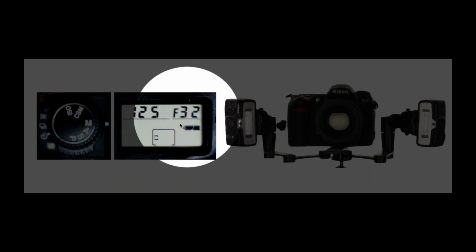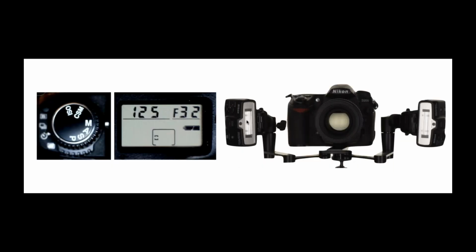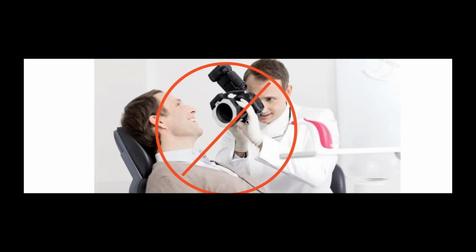Remember I showed you when I had an f20 compared to an f32, that the photograph appeared slightly darker on the f32. So how did I fix that? I just push the flash up a tiny bit and get a little more brightness out of the flash. But I'm getting a more accurate photograph, and I'm just brightening up with my flashes. So that's why the flashes are so critical for us.